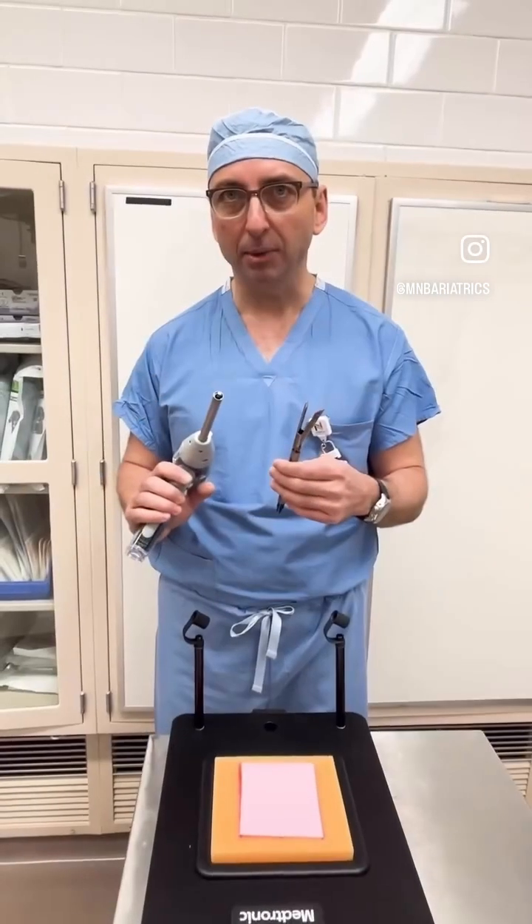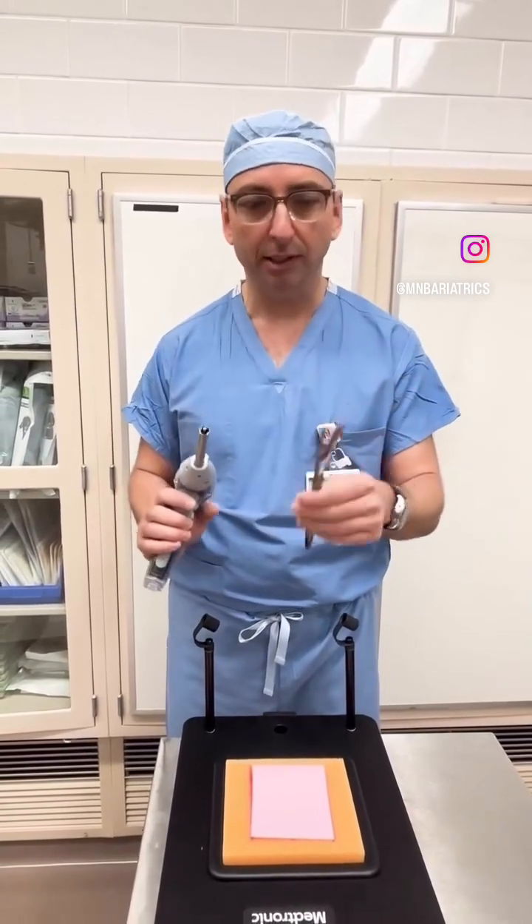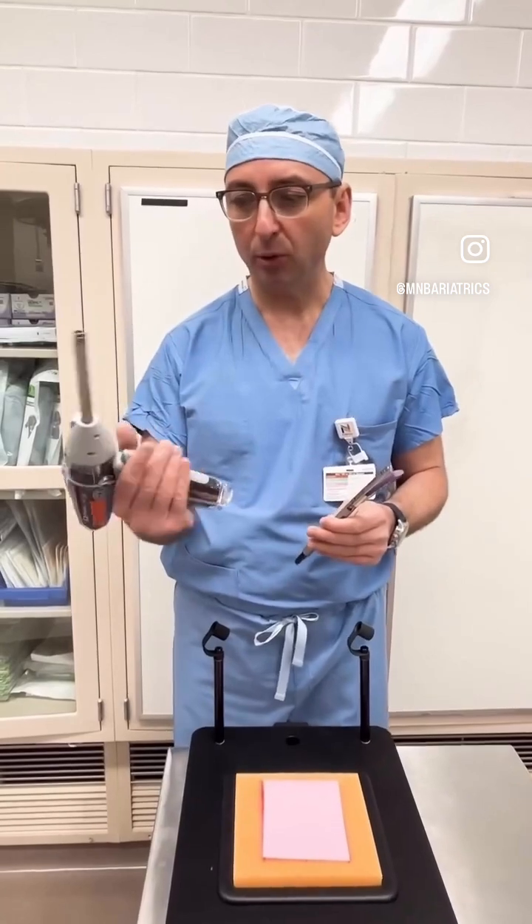Patients ask how do we cut the stomach in a sleeve gastrectomy or in a gastric bypass. We use an instrument called a stapler.